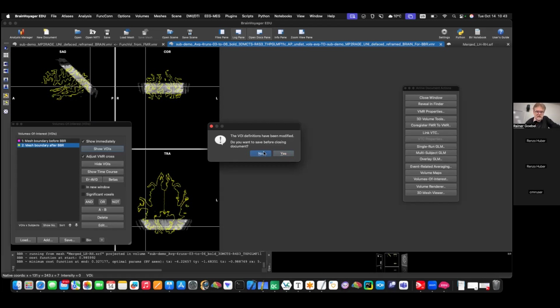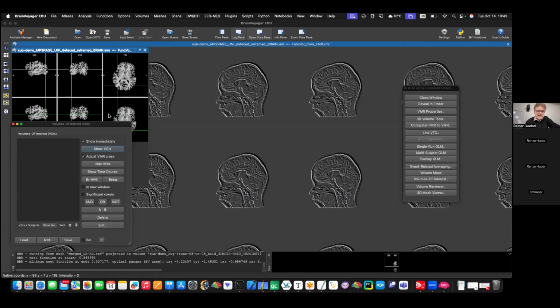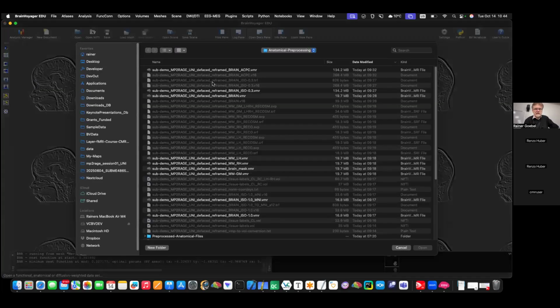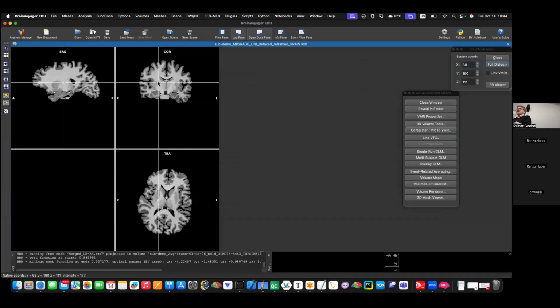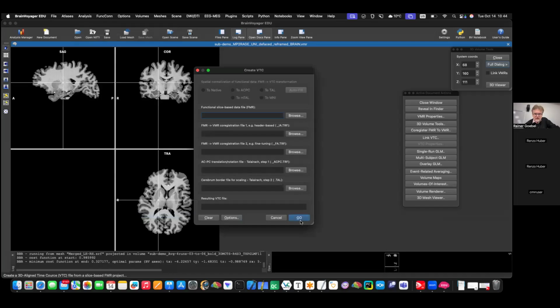Okay, so we load again, close everything for now. And then you open up again this brain file we used for co-registration. The same one, because this is our host. We now bring the functional data to this and go on to our 0.3 space. We had here done the BBR to this one, right? And now comes a function which is also fortunately scriptable. It's a bit of a long one, but I show you this in the graphics.